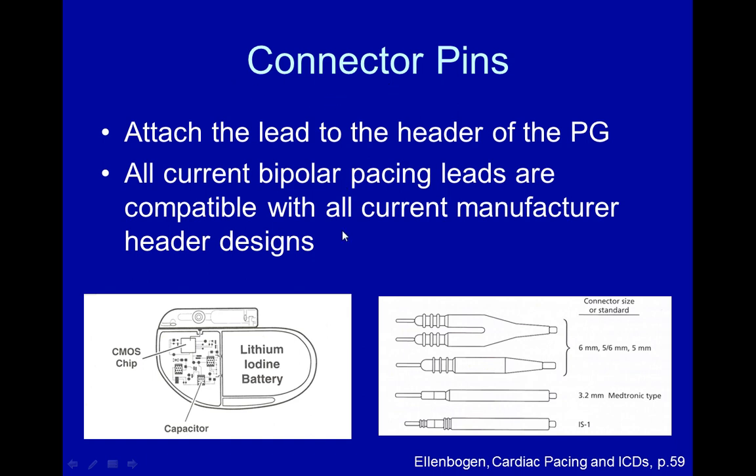The connector pins, the older versions had 2 separate pins for each electrode, but now most of them have one single connector pin that goes into the connector port, or what's called the header. And the important thing to remember here is that all current bipolar pacing leads are compatible with all current manufacturer header designs. So if you look at a patient's medical record, you might see a St. Jude pulse generator and Medtronic leads.